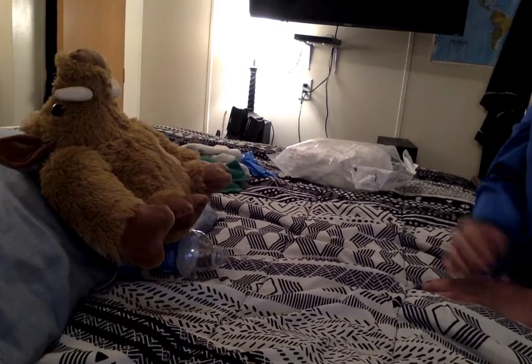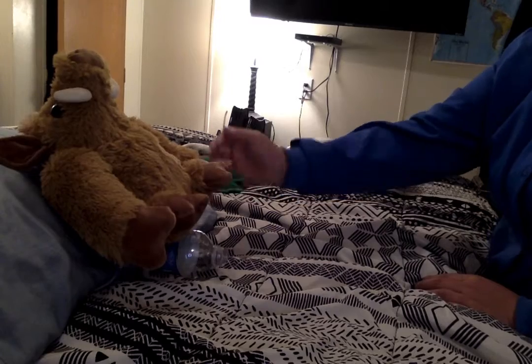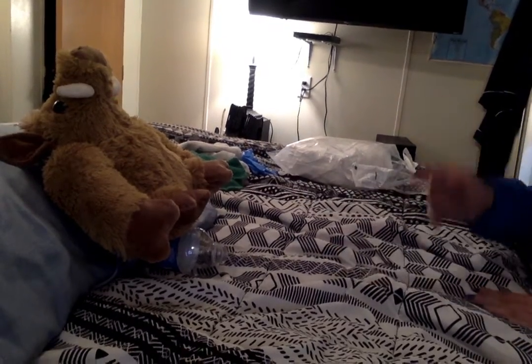The next thing I'm going to do is ask Miss Lynn if she has any allergies. So, do you have any allergies? She says no. I ask her, are you sure you're not allergic to iodine or shellfish? And she says no. That's fantastic.